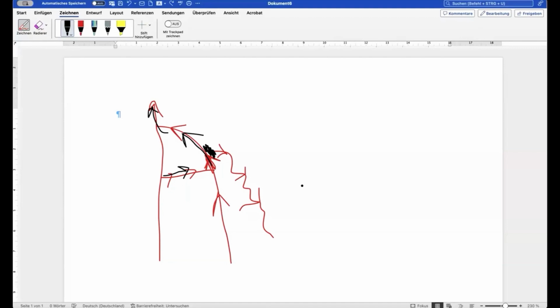All right. But if he was symptomatic, or if he asked me to treat him, I would start just like I pictured here. I would start disconnecting the tributary from the great saphenous vein. You can do it with foam sclerotherapy, you can do it with a surgical disconnection, you can do phlebectomies, whatever, but not touching the great saphenous vein, which is completely healthy. For the foam, sometimes we cannot really control where it will go. In this scenario in particular, some of the foam can go to the perforator. What will be your tips and tricks here?